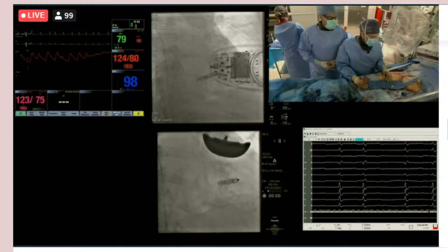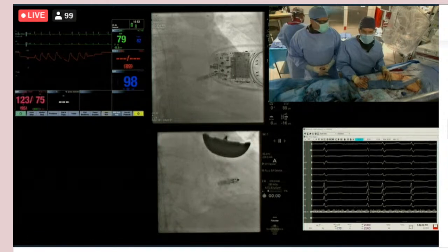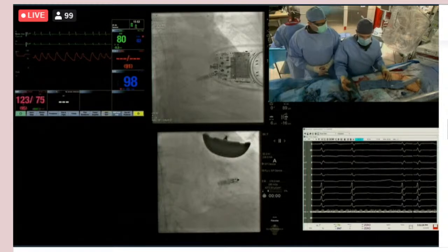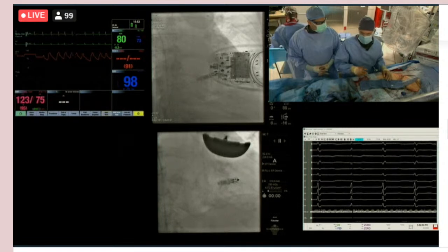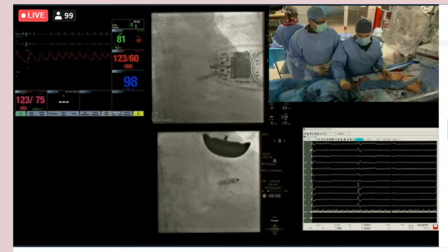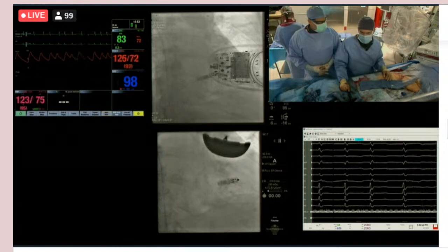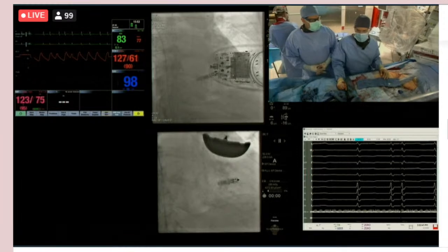It's really nice. When you're pulling the tether, David, are there any tricks that you've learned? How do you do that? Thank you for asking. Good question. On the sheath, I give a retrograde flush to make sure those tethers are really wet. Cut and then just pull slow and steady. You'll often feel the heart beating against your fingers for the first few pulls. Yeah.